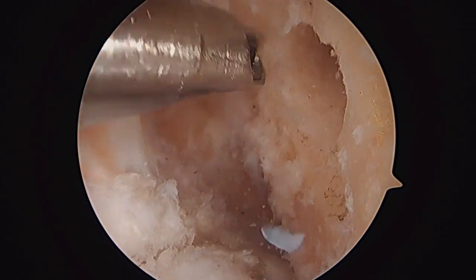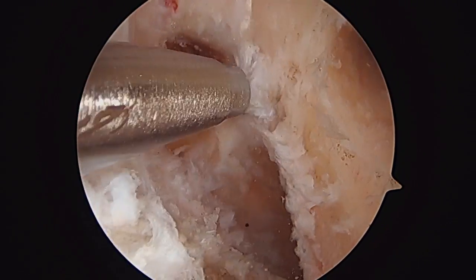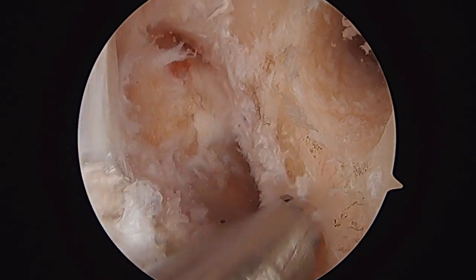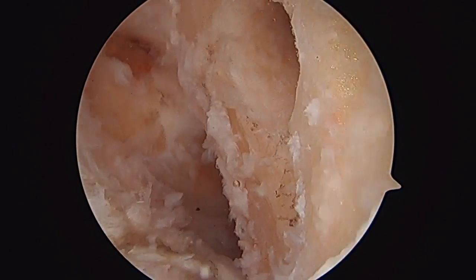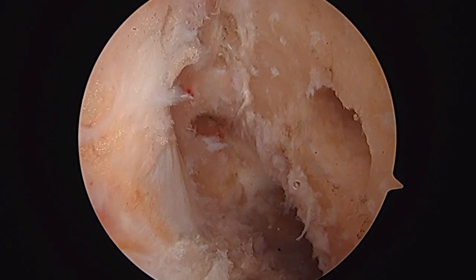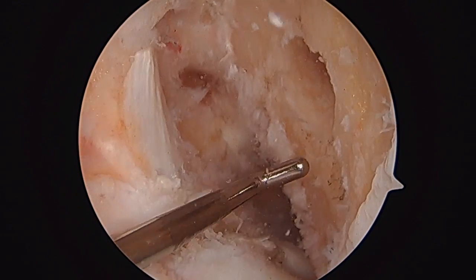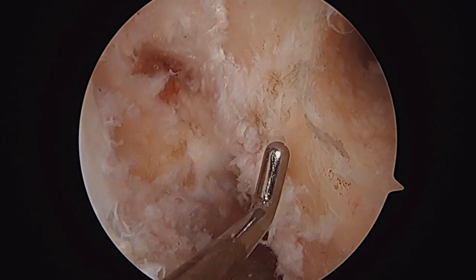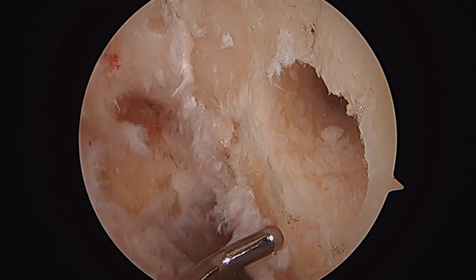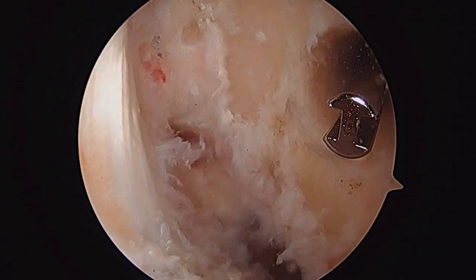So I get a shaver, I check I'm still below Blumensaat's line, I'm still behind resident's ridge. I can see how much back wall that I have left. I know how big a graft I have, so I can do the math in my head to see what my ultimate drill bit's going to be, and I work up to that drill bit. So I start off with the 4.5, then the 6.5, which I've done, and then I'll usually use one more intermediate drill bit before the final drill bit size. And again, we're sequentially asymmetric drilling this tunnel to allow this to be placed in a truly anatomic position.